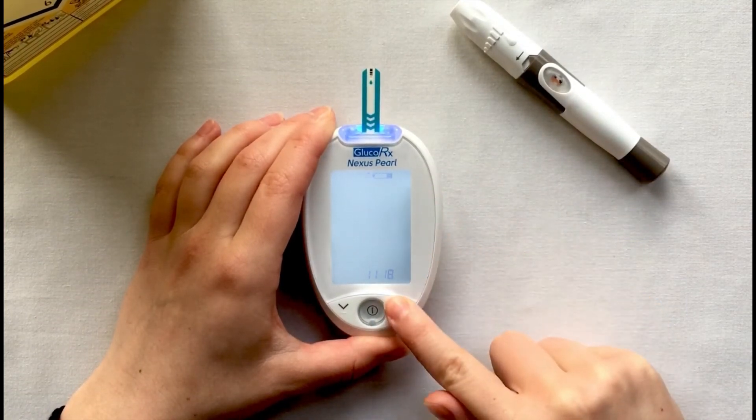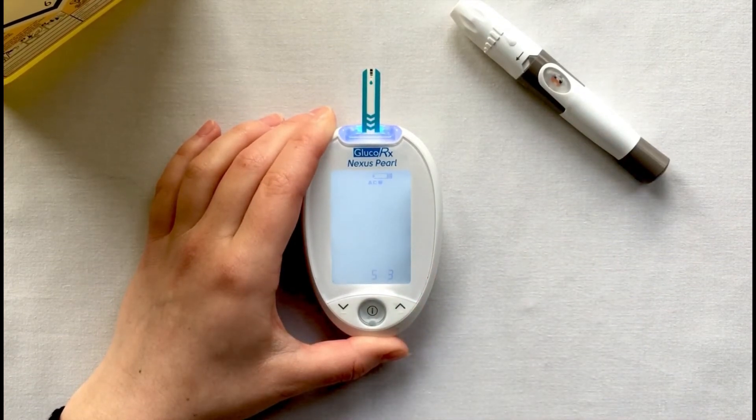It is important to select the correct measuring mode with each reading to benefit from the colour light indicators. Then put your meter down.